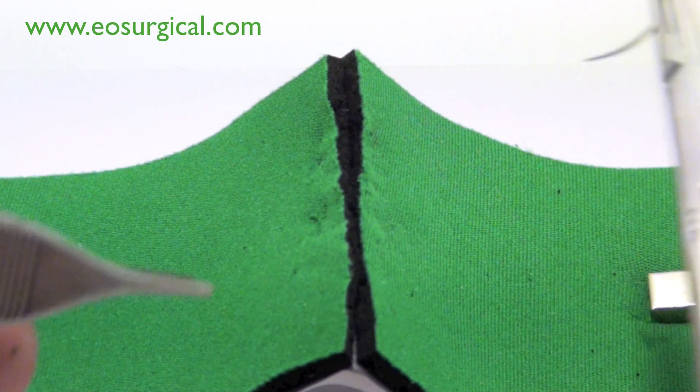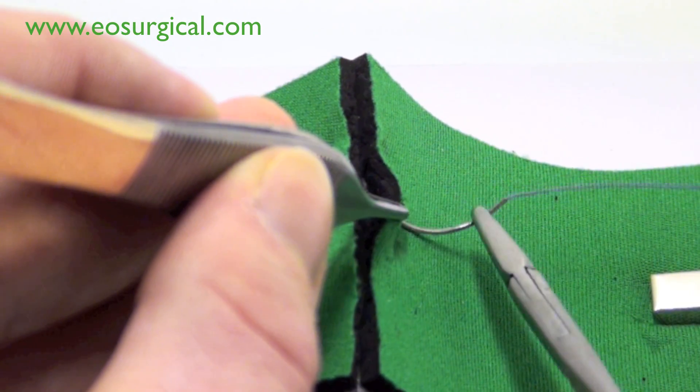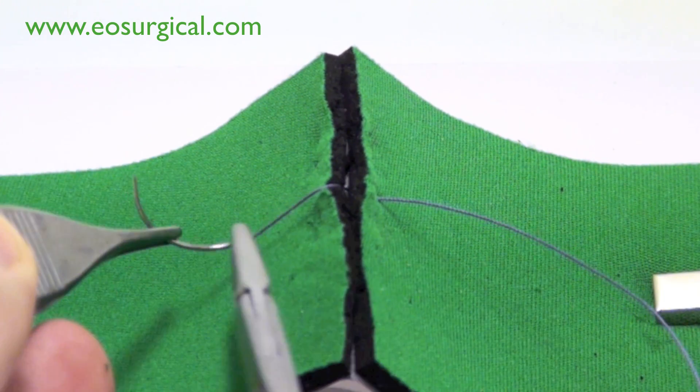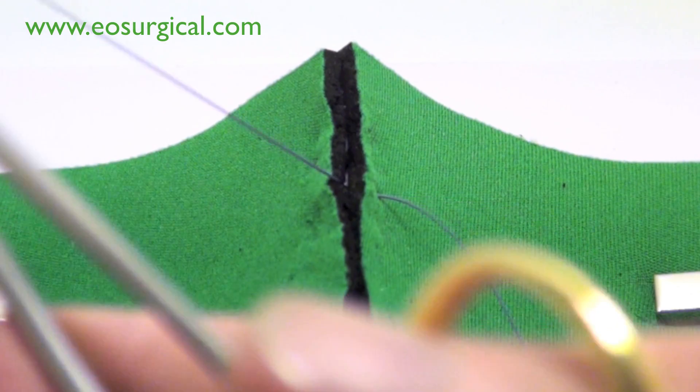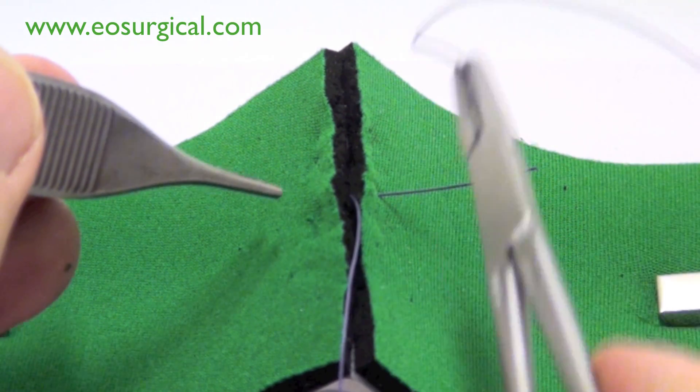Now, let's look at this on the simulator. This is the needle entering the tissue at point A. Note how the needle is curving through the tissues and following the curve on the needle itself. This causes a minimum amount of tissue damage.